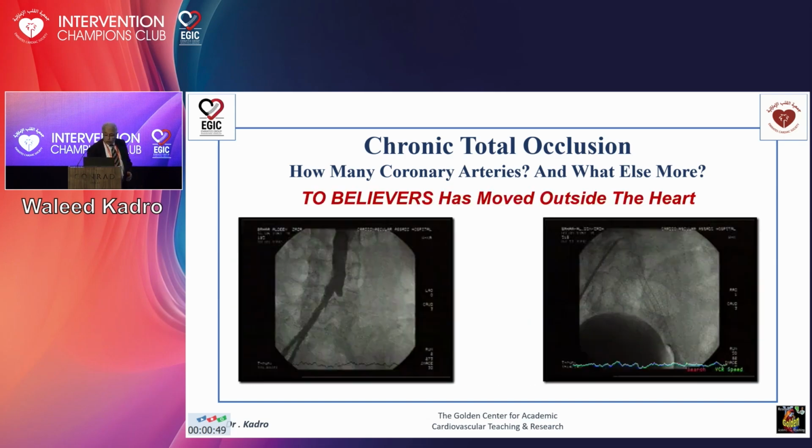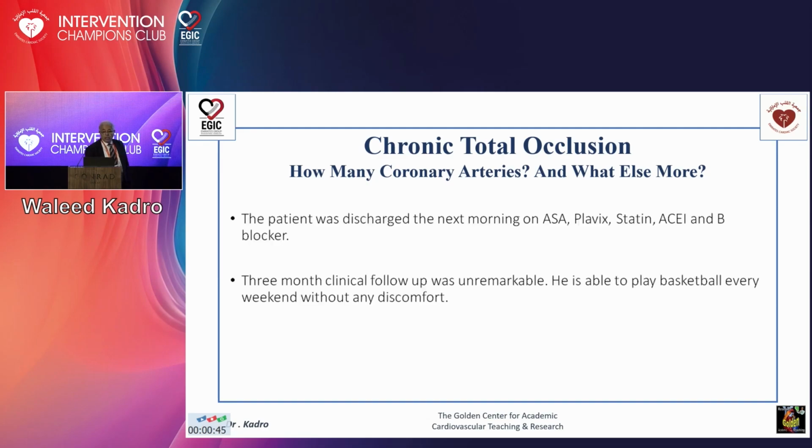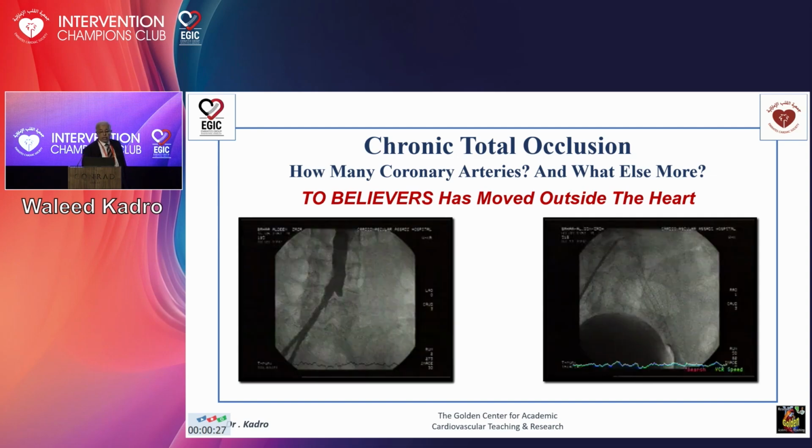This is our protocol, that we don't use any retrograde thing. We don't use any contralateral injection. We don't use any anchor device. We don't use parallel wire. All of that, I think, is just to show off or make the case complex. Just you do your simple thing. And with that, we were able to go outside the heart.